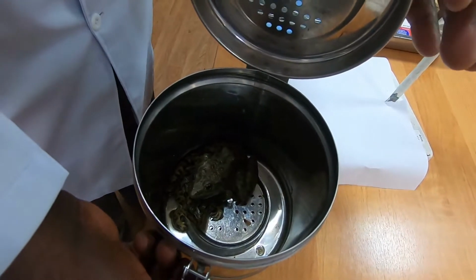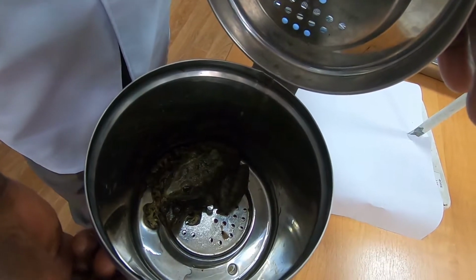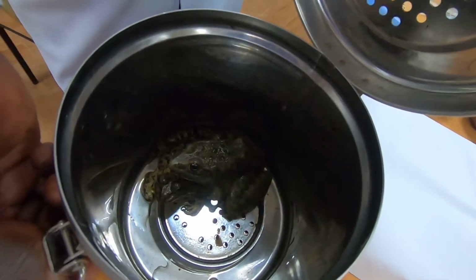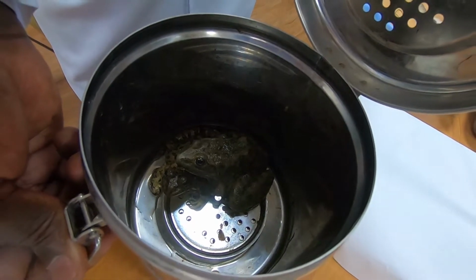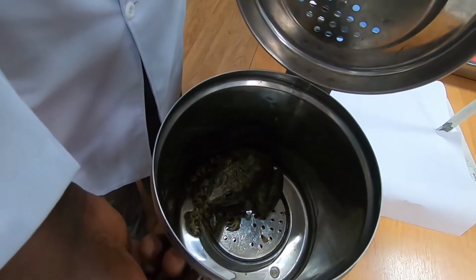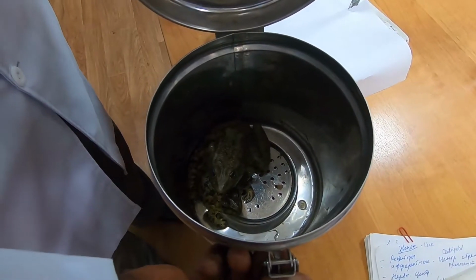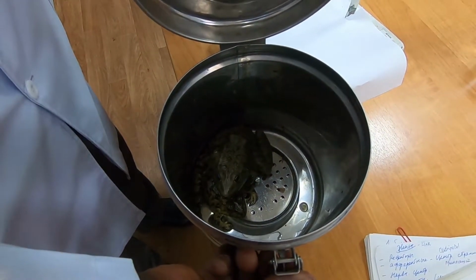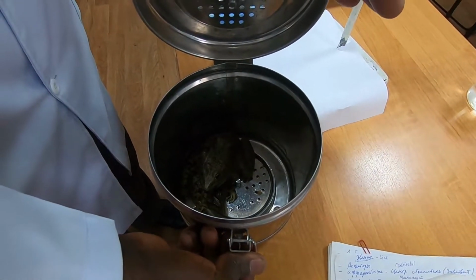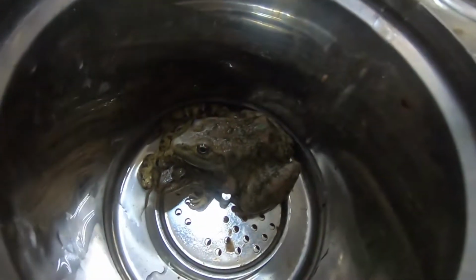frog. Here we have two of them. If we are able to get insulin, then we're going to do the second experiment. If not, we're going to use only one. Okay, have a look at them again and say hello to them. Say good afternoon, my dear students. I want to show you how one of my eyes reacts to adrenaline and how one of them reacts to solution of Ringer.